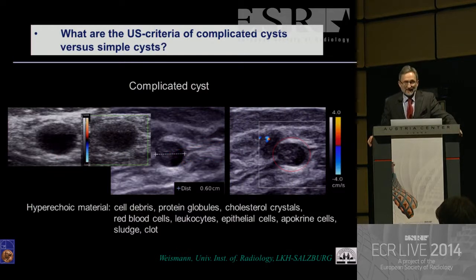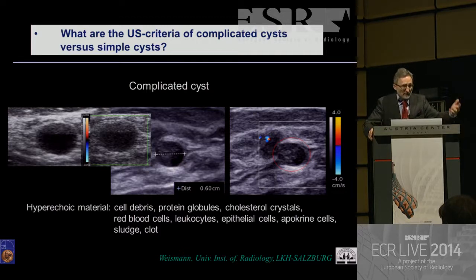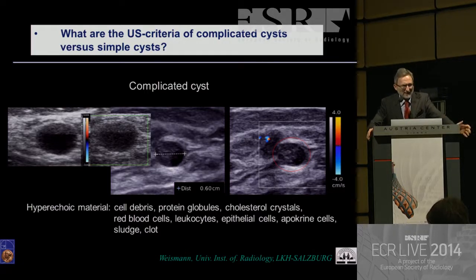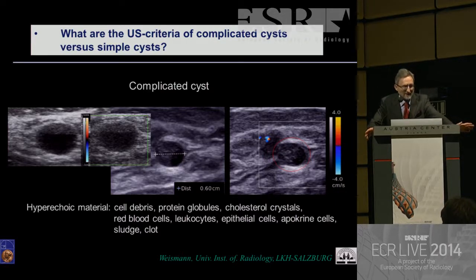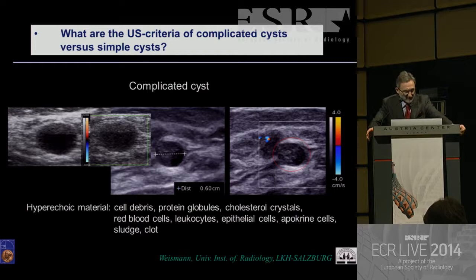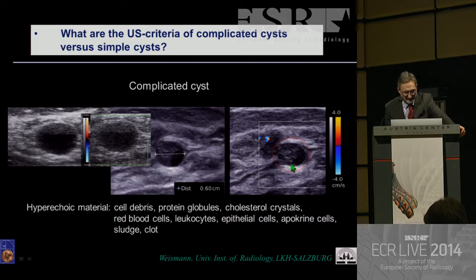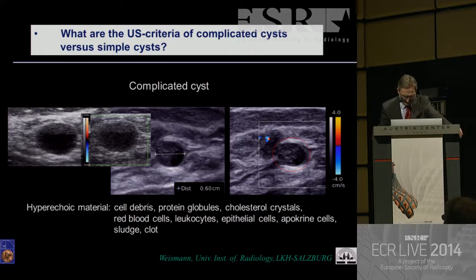The next point: go for a color Doppler and study whether there is perfusion inside this hyperechogenicity. If you find vascularization inside, then there is something wrong — this has nothing to do with a complicated cyst. You don't see any vascularization in the fluid level or inside the complicated cyst. Outside can be, but not inside.